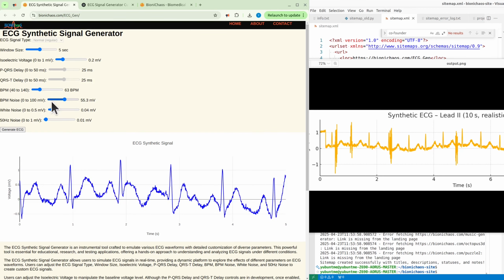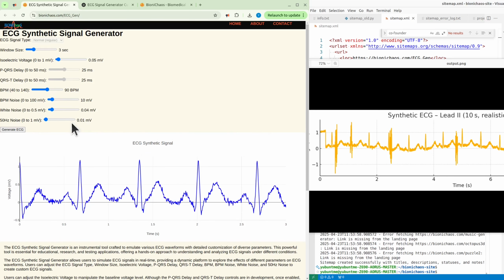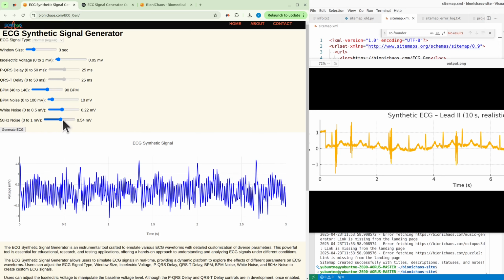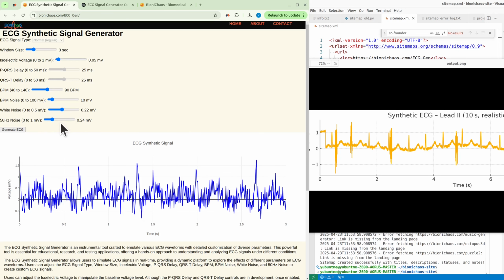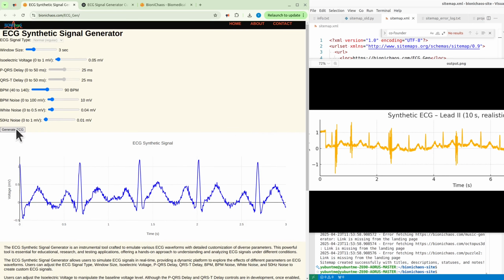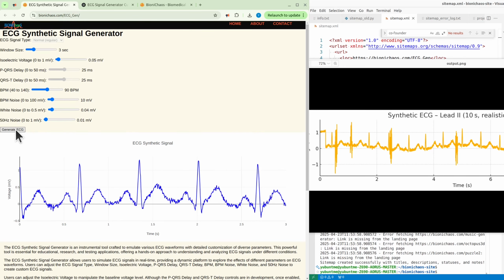For BPM noise, here I have some variability to the peaks. Let's reset it. Just reset it by resetting the page. There's no button for it. And you can add the white noise and 50 Hertz mains hum noise as well. Let's reset, and you can keep generating variations of the same waveform with the same settings. So that's pretty much all it does.